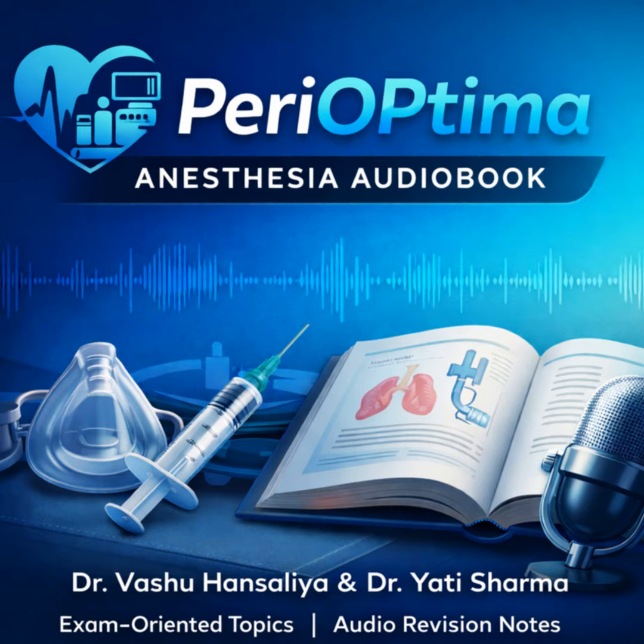The spray-as-you-go technique. A crucial exam detail here is the downside. These narrow channels are notoriously difficult to clean and sterilize. That raises real concerns about cross-contamination. Let's talk about the optics, the physics of how a flexible cord transmits a clear image. Examiners love to probe this.